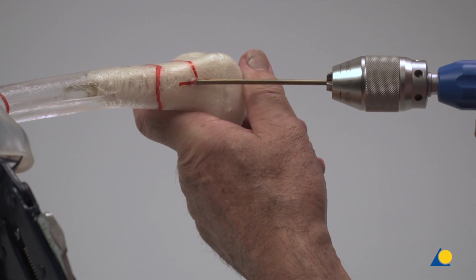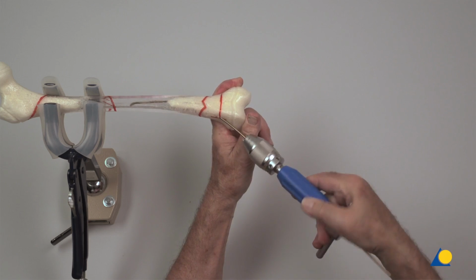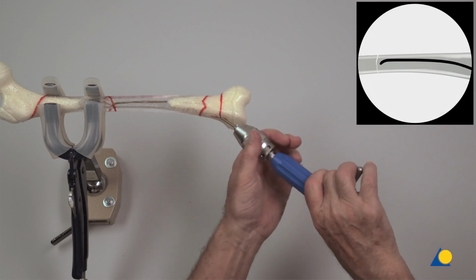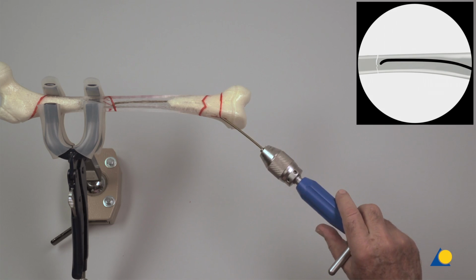The first nail is advanced to the level of the fracture. The rotation of the nail more than 180 degrees during insertion must be avoided. Clinically, the advancement of the nail is regularly monitored under image intensification.